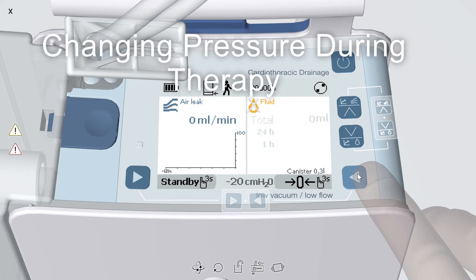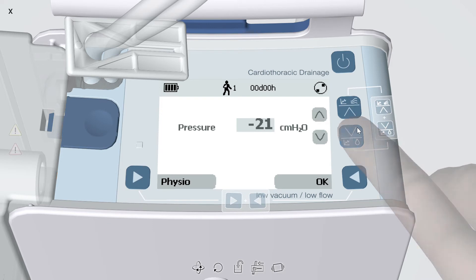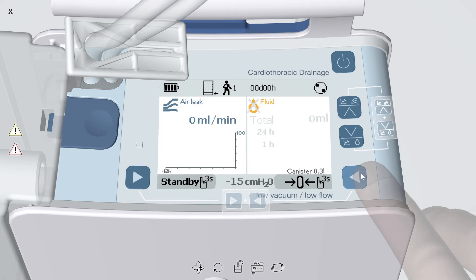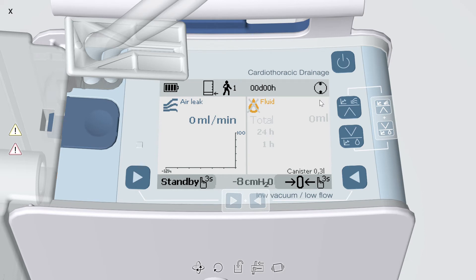To change the pressure setting while therapy is active, press the two lateral arrows simultaneously. Use the up and down arrows to reach the desired pressure and press OK to confirm. The equivalent setting for wall suction is negative 20 centimeters of water. For patients to be treated by gravity drainage or water seal, the physiological pressure of negative 8 centimeters of water can be activated by pressing the bottom left arrow or physio. Press OK to confirm.